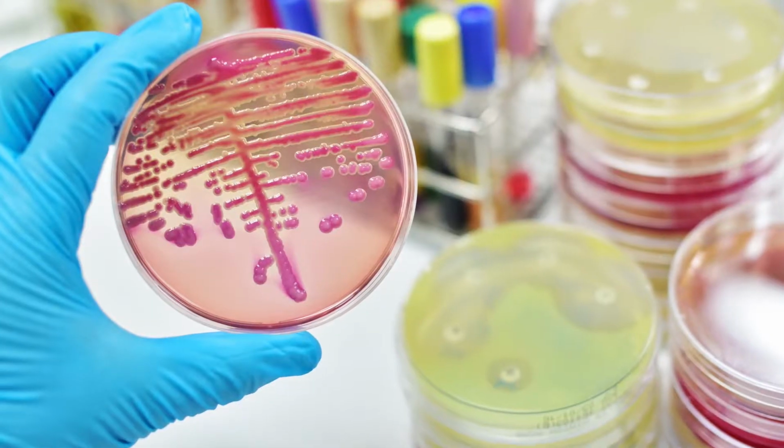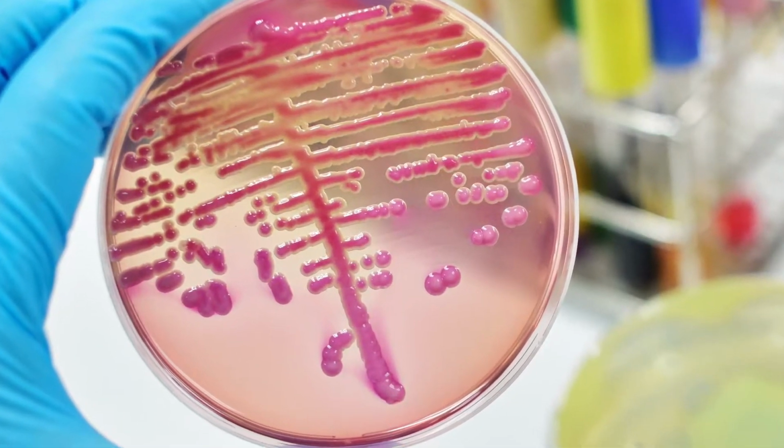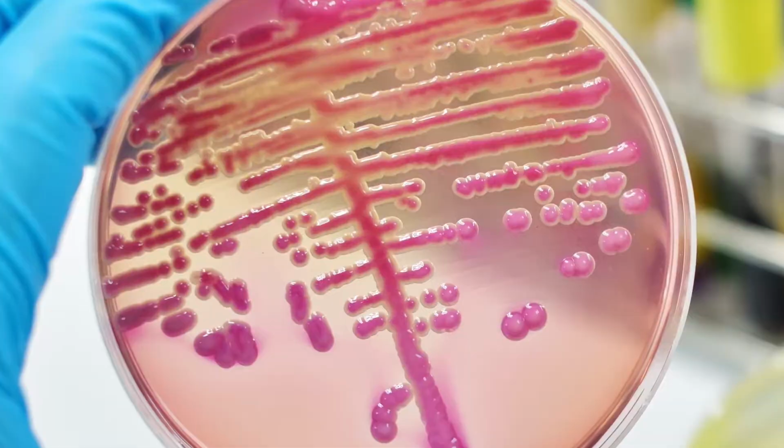Now, either way, one of the big goals for quality treatment and for a quality root canal is to create an access in the canal for your irrigation needle to penetrate to the depth of that working length. So the apical third is where the largest amount of bacteria reside inside that tooth, and it's also where disinfection is the most critical. Now, the wider the preparation of the canal, the more likely you will get the irrigants, those antimicrobials, to that working length.